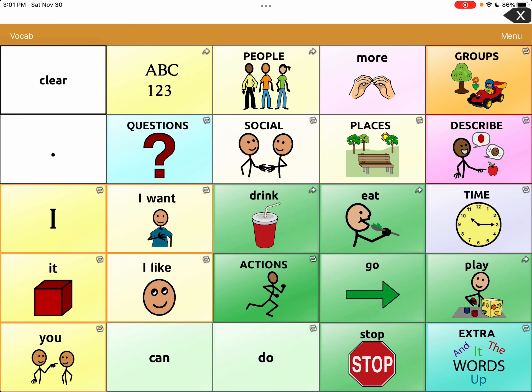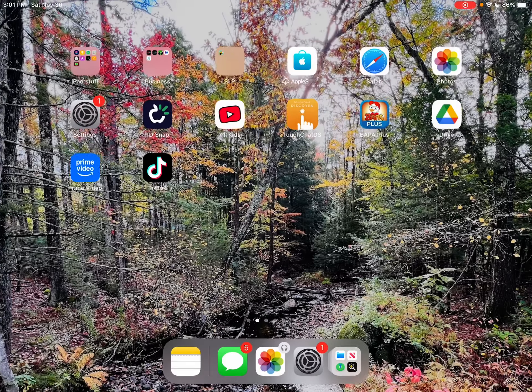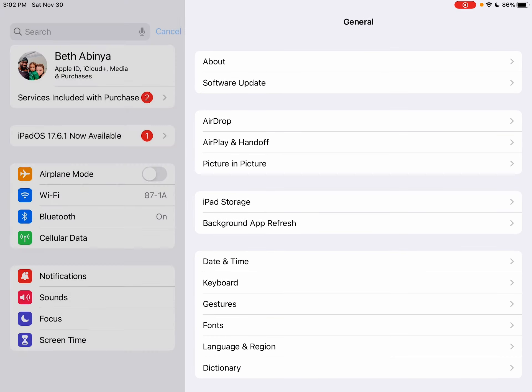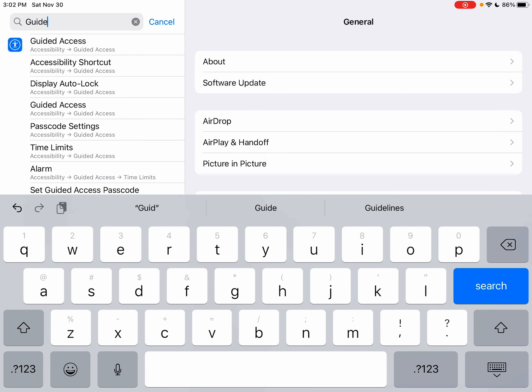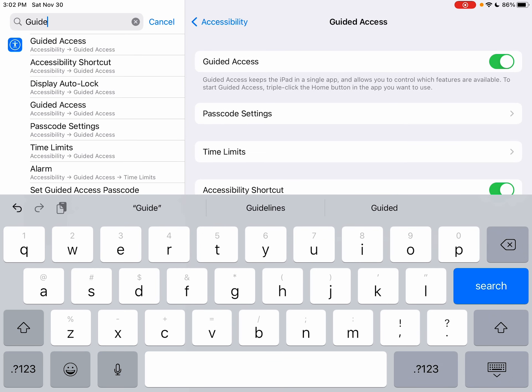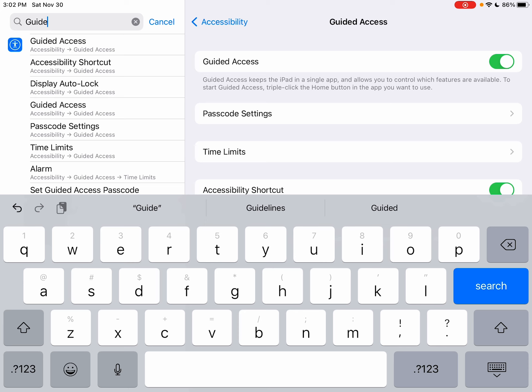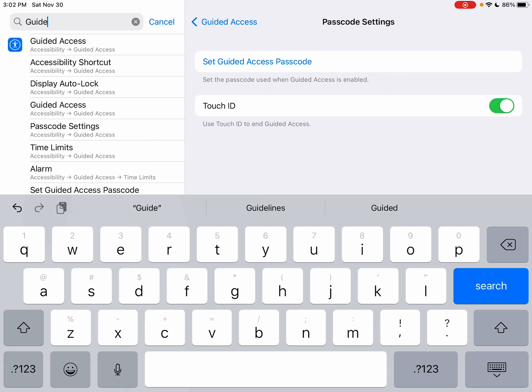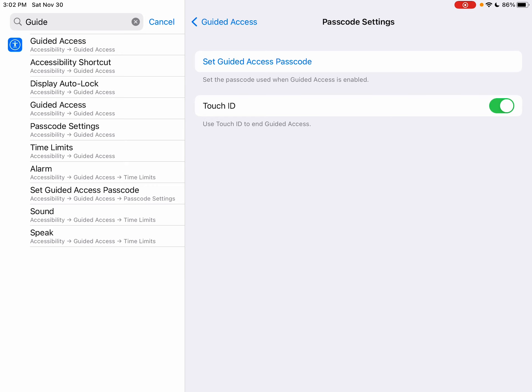In case anyone doesn't know how to use guided access, I'll hit the home button and go to Settings. I searched for 'guided' in the search bar and it came right up at the top. Click on that, then go to Passcode Settings and hit 'Set Guided Access Passcode.' I'll enter one — just make sure it's one you're going to remember.